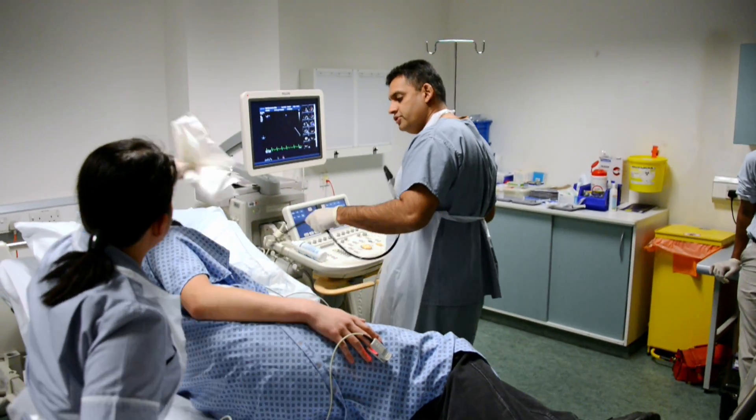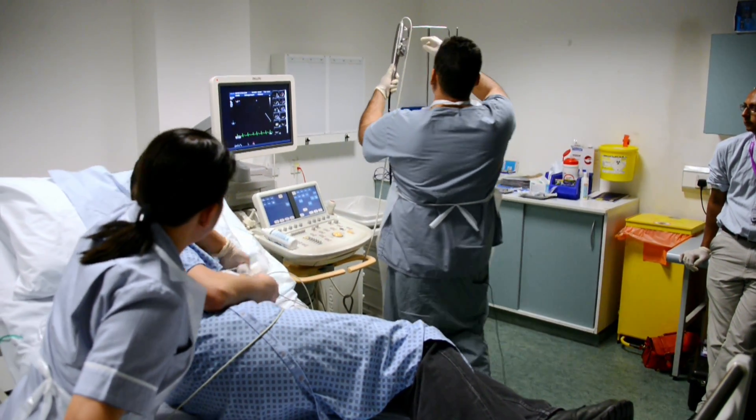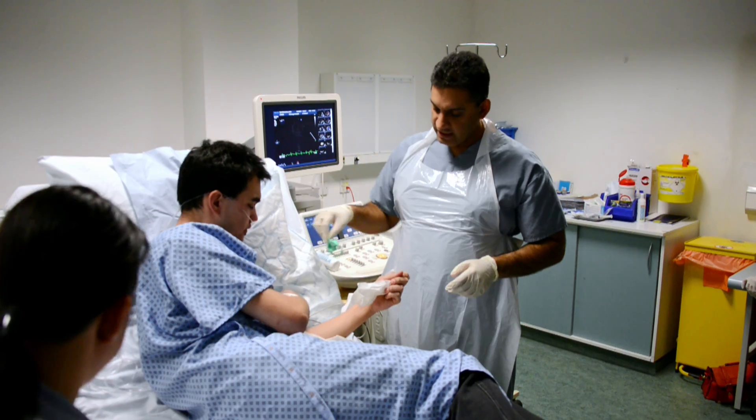Well done. We'll sit you right up now. Afterwards, the throat will feel sore for three to four hours, but you can eat and drink after two hours, and then there really are no long-lasting effects at all.